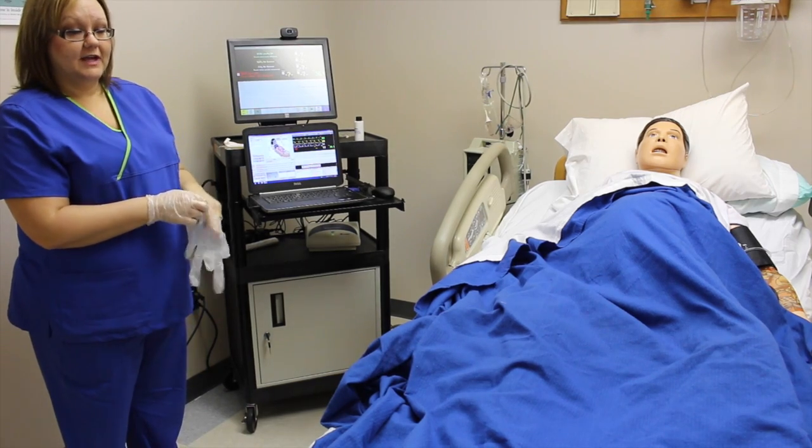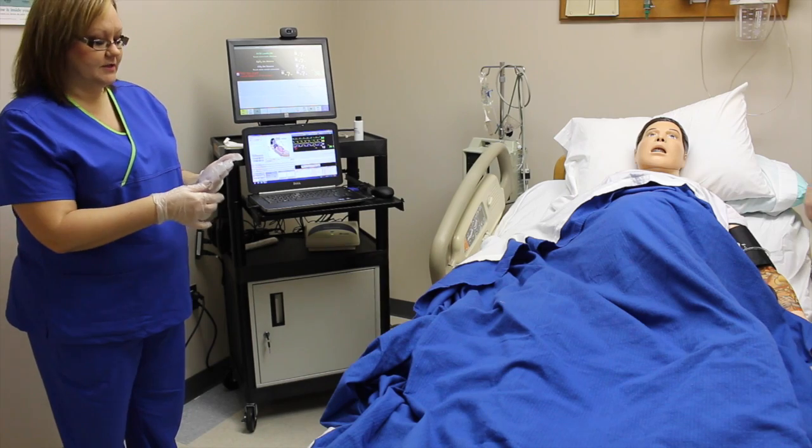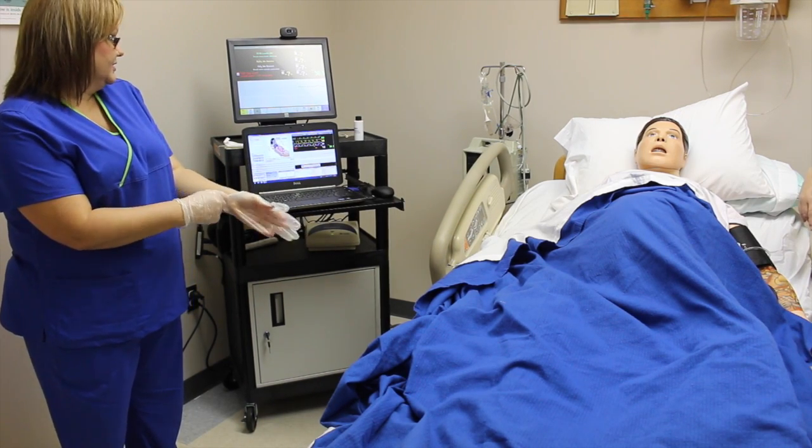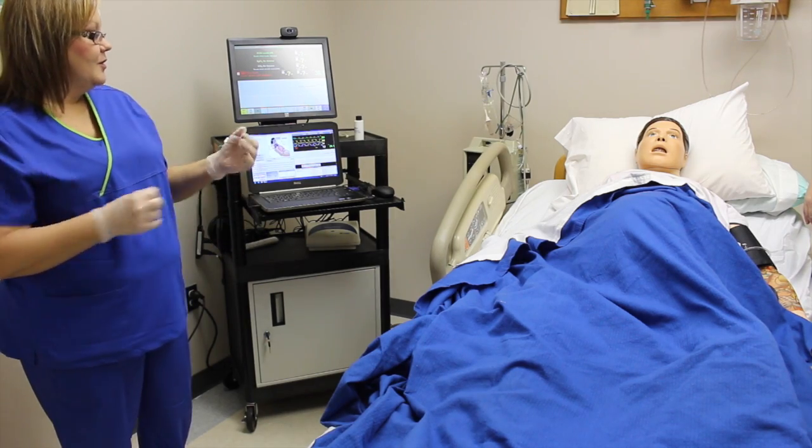Now, fetal heart rates can change at any time, so you may see late decelerations, variable decelerations, early decelerations, or no accelerations in there. It's just kind of random, and it depends on each particular baby.